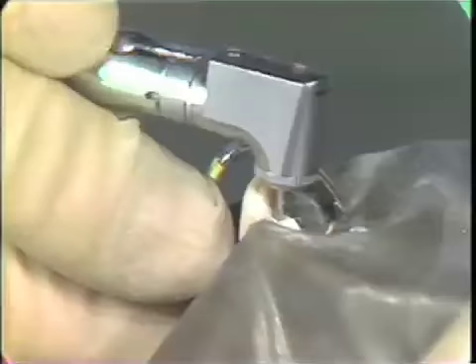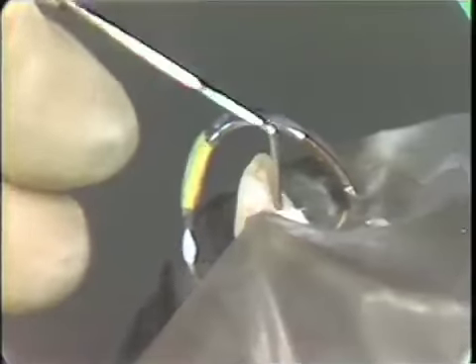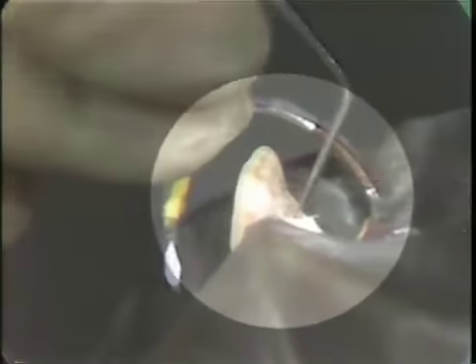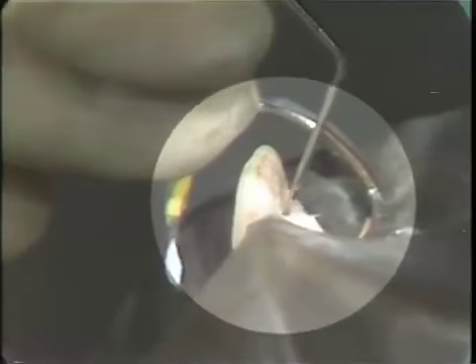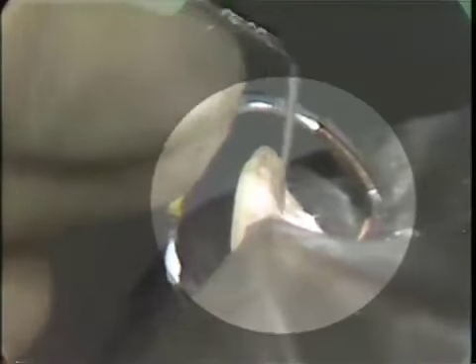I check again. It feels fairly good to me, so I put my slow-speed handpiece aside. With my Endodontic Explorer, I'll go down and check. Yes, I can get access into the pulp chamber. Come around. Feel smooth in all directions. I can feel fairly confident that I have removed the entire roof of the pulp chamber.